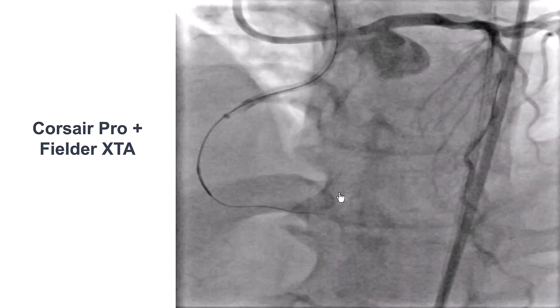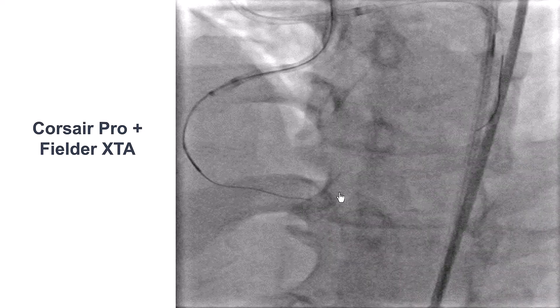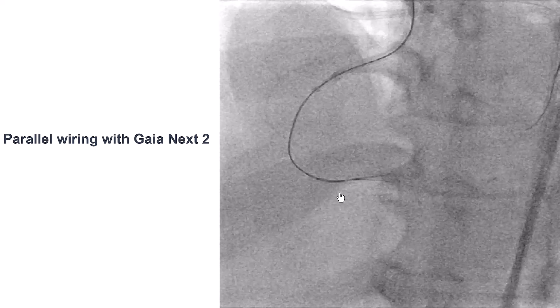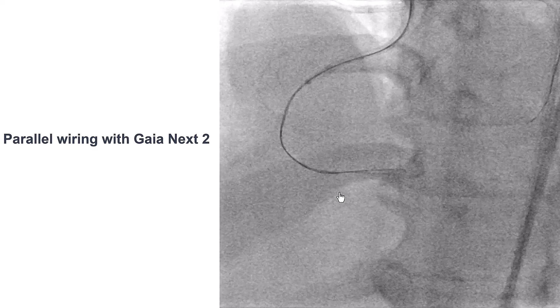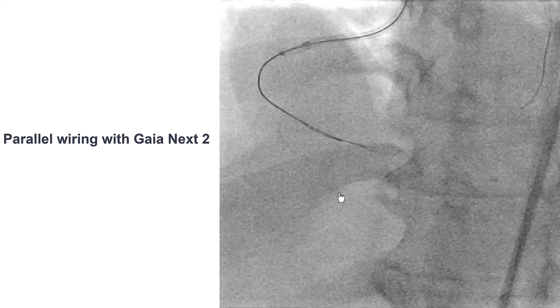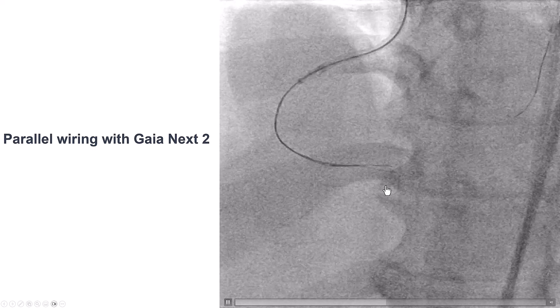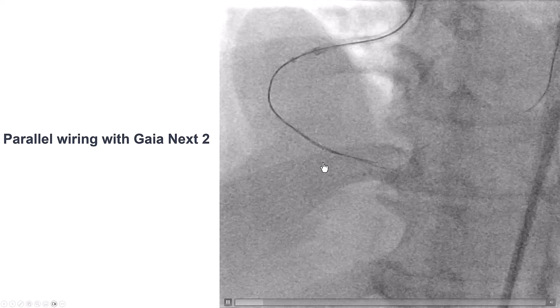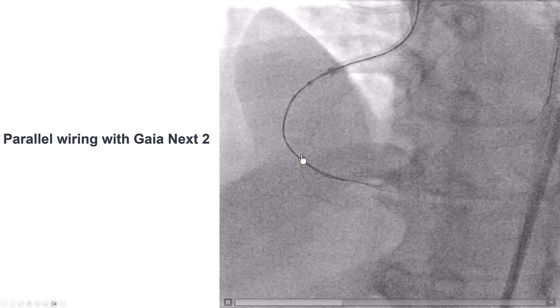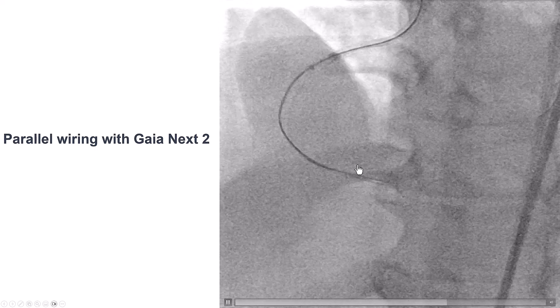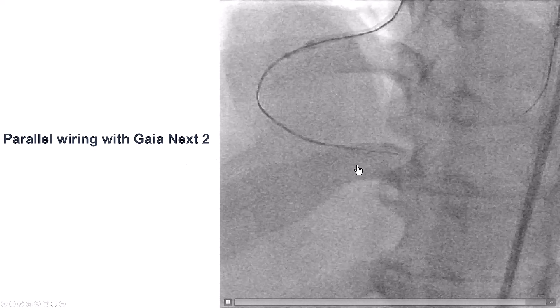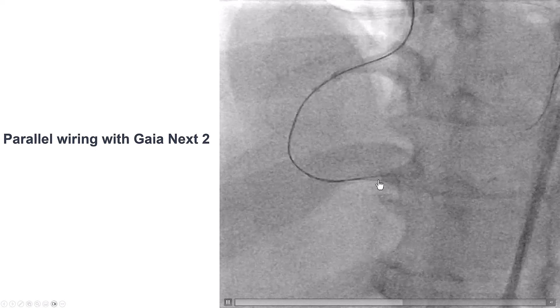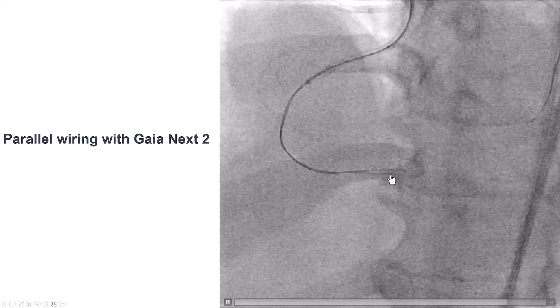It is always good to prepare for a less-than-ideal scenario. The options here are to either do antegrade dissection reentry, use another wire with the parallel wire technique, or pull back the wire and redirect. In this particular case, we decided to leave the Fielder XTA wire in place and then try the parallel wiring technique. This is best performed by putting another microcatheter over the second guide wire and using a more penetrating, torqueable guide wire — such as the Gaia family of wires — to wire in a different plane compared to the original guide wire. The original guide wire serves as a marker of where not to go and guides the direction for the second guide wire.